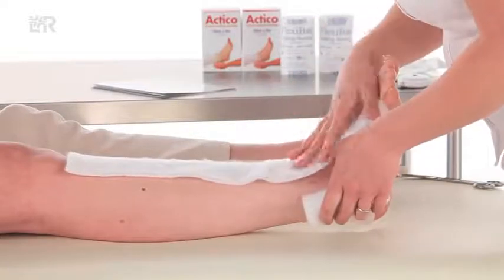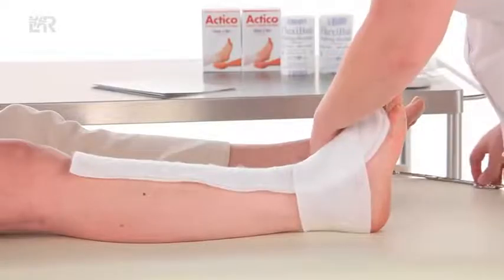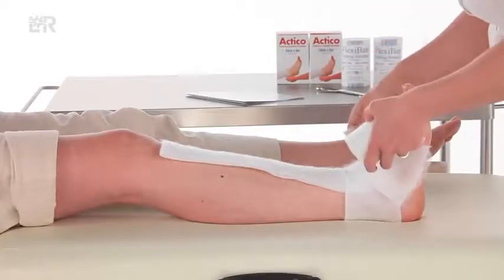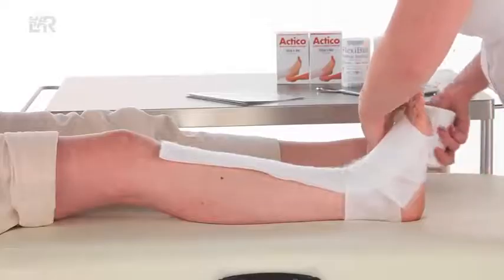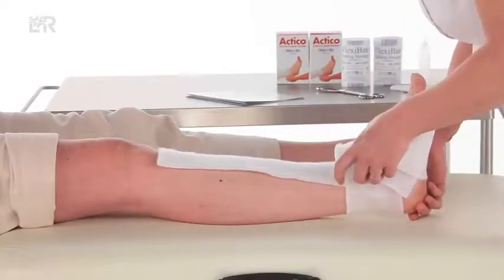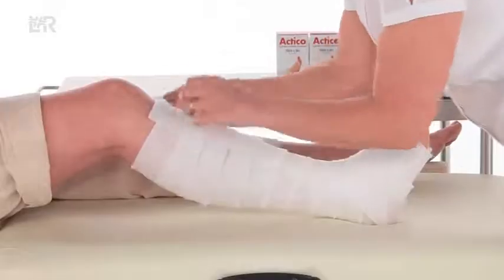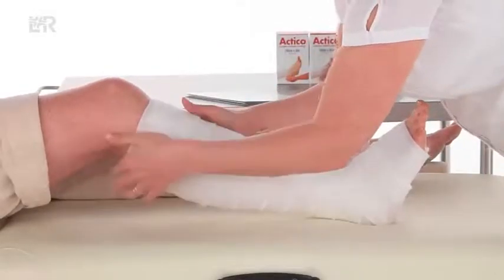Measure the ankle, reshape and protect the limb if necessary by applying flexiband padding. Please position the foot toes to nose when applying the padding. Secure the padding with two turns at the base of the toes and with a figure of eight at the ankle, before using a 50% overlap spiral up the leg. Finish the padding 2 centimetres below the popliteal fossa.